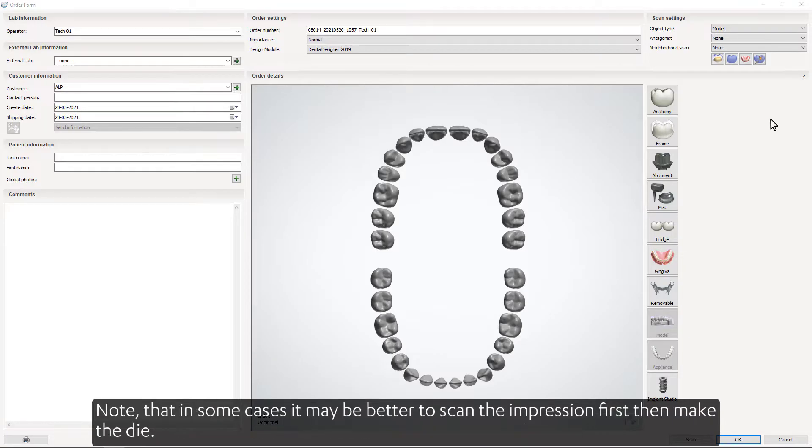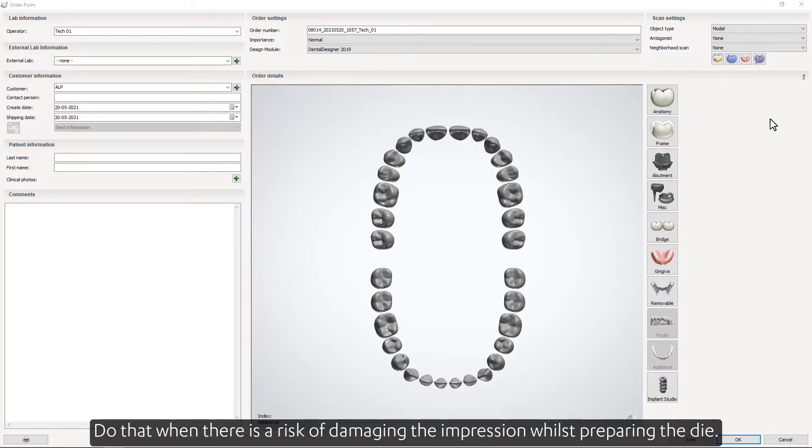Note that in some cases it may be better to scan the impression first, then make the die. Do that when there is a risk of damaging the impression whilst preparing the die.